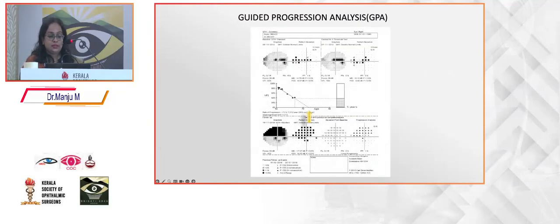So this patient had taken the first visual field and second visual field, and the patient was lost to follow-up for some years, and now this is the patient's visual field. If you extrapolate the data over 5 years, the patient is going to go blind. It's almost 0. So if the same rate of progression continues over 5 years, the patient is going to become blind. So the machine, or the program, is practically telling you that you need to do some intervention, either increase the medication, do a laser, or surgery. You need to do some intervention to reduce the rate of progression at this point so that the vision can be preserved for the patient.